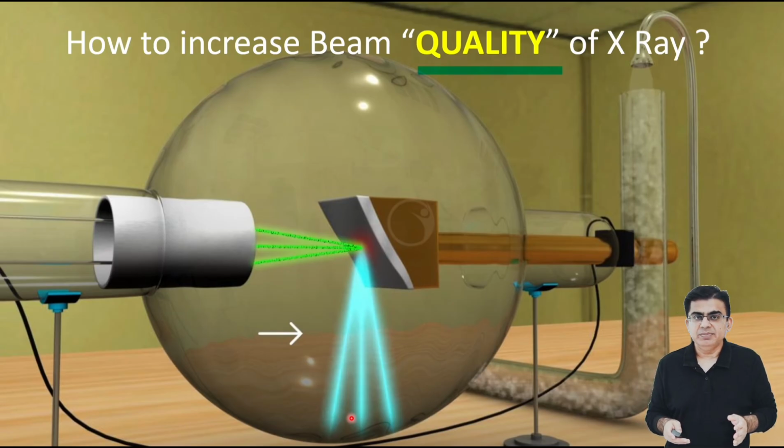This simple relationship is the absolute core of our treatment planning. In our daily clinical practice, you will constantly use these exact principles to control both the quantity and the quality of your radiation beam.